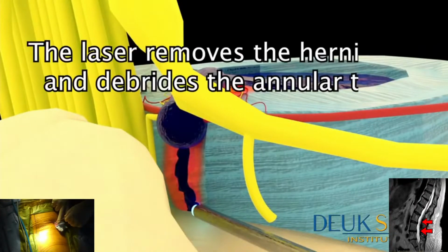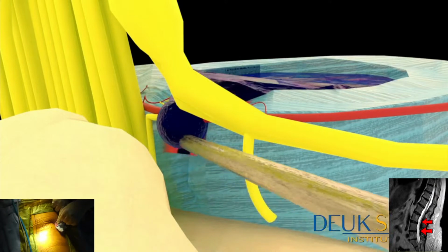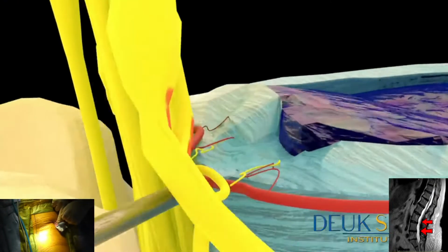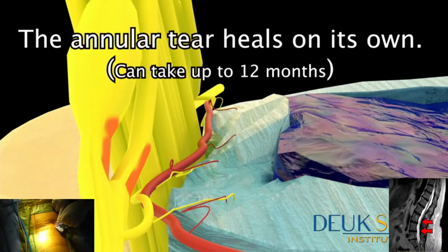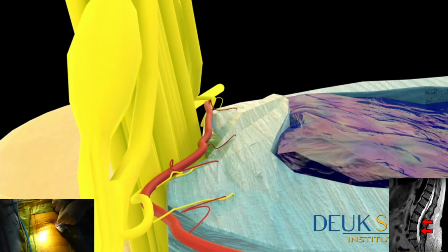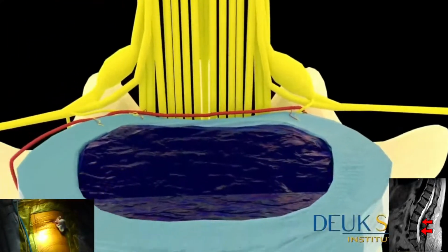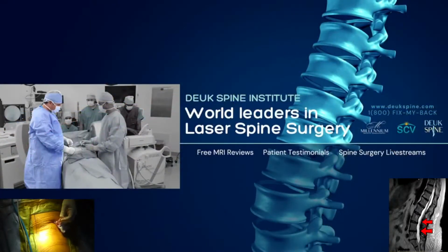The laser removes the herniation and debrides the annular tear. The annular tear heals on its own. If you have a herniated or bulging disc and back pain, submit your MRI for a free review at www.mri.deukspine.com.